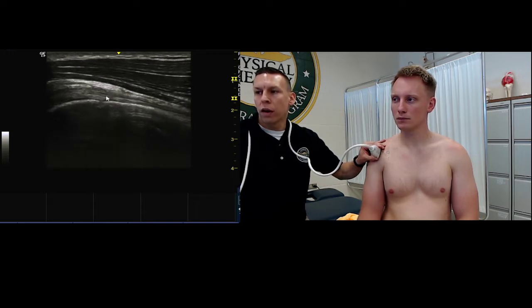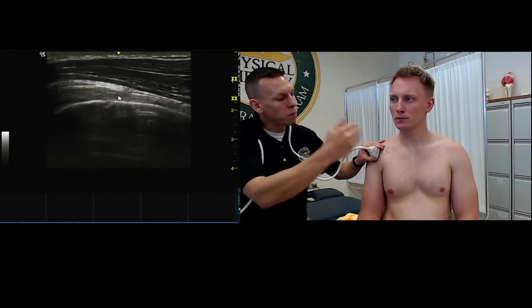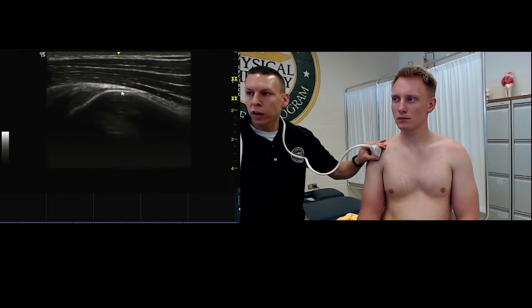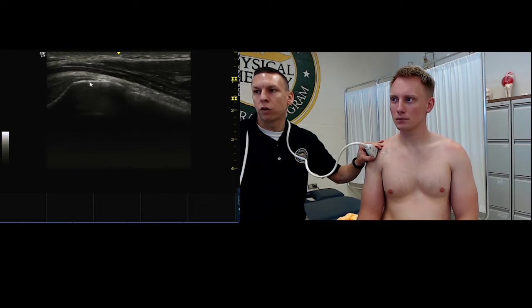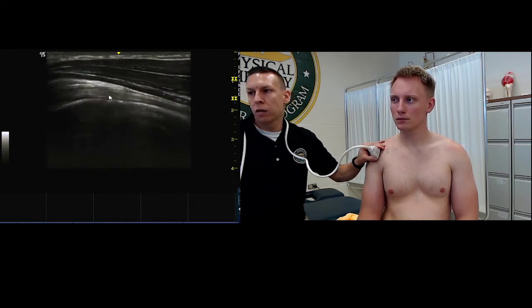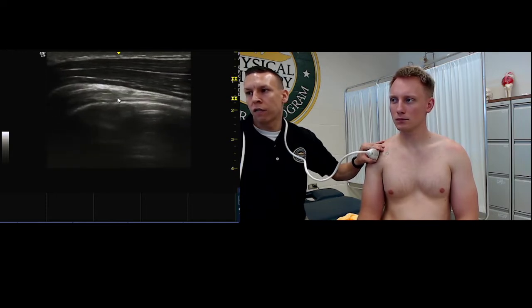Now, if you have a hard time finding it, you can just slide your probe medial and lateral. And so if you come medial, it should run into the lesser tuberosity. If you come lateral, it should run into the greater tuberosity. So it kind of goes bone, tendon, bone. So once you know you're here, you can start to identify it.